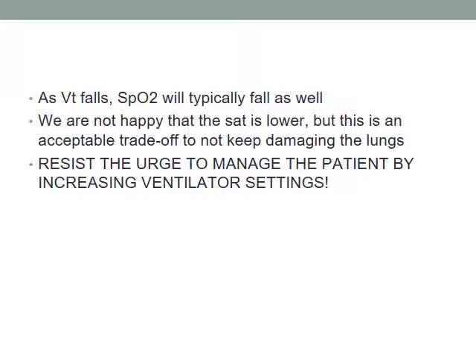Now, had this number been 82, what changes would I have made in his care? Probably nothing. I looked to see whether I could treat fever, which he wasn't febrile, and make sure his hemoglobin is pretty good, those sort of things. But I'm not going to change anything on the ventilator. I'm tickled pink with his ventilator settings. These settings are consistent with not having any ongoing lung damage, and these are lungs that might get better. So as long as I can keep him alive, he has a chance of getting better.